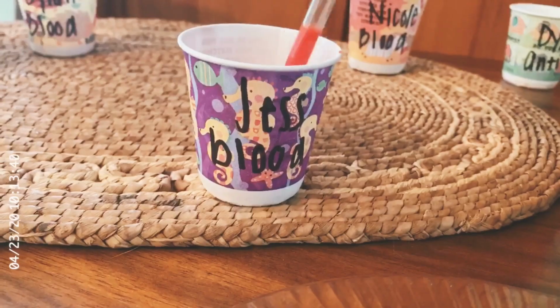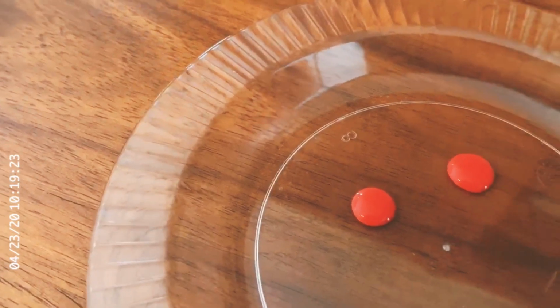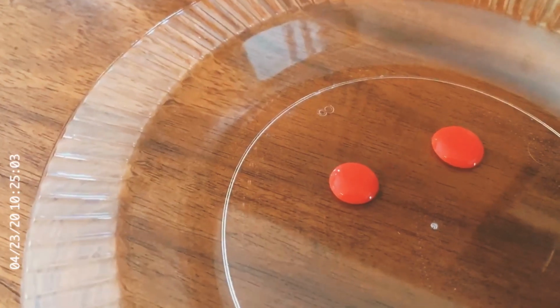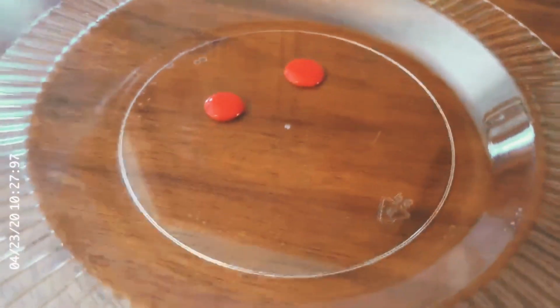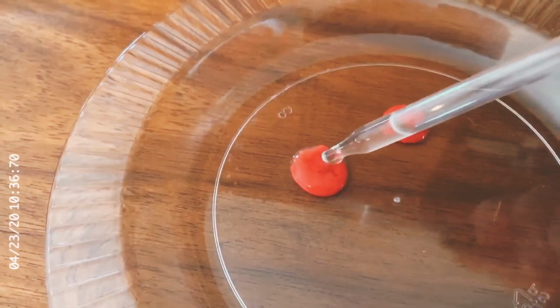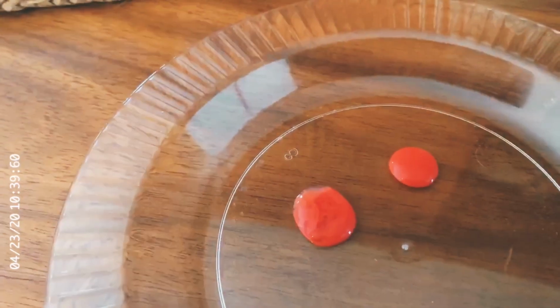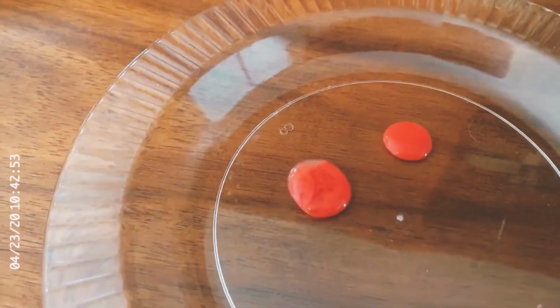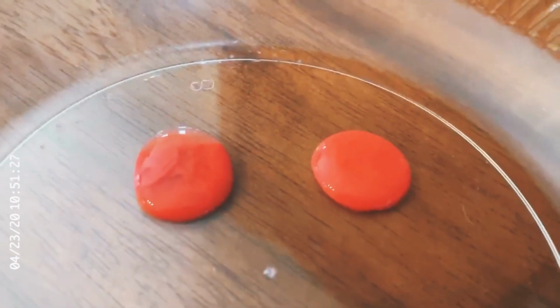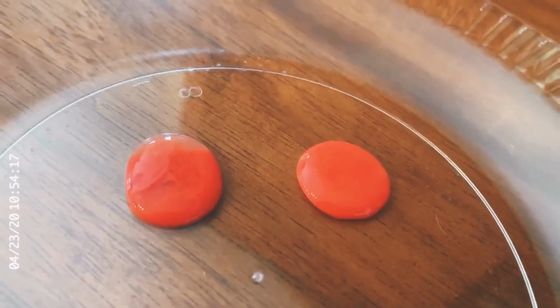Let's do Jess. We're gonna get her blood sample. Two samples on the plate. We gotta find her anti-A and anti-B. They're of course really far away from me. They're back here. Jess. We're gonna do anti-A first. Okay, and then we'll do our anti-B. We're gonna look at our results, write down our positives and our negatives for Jess.